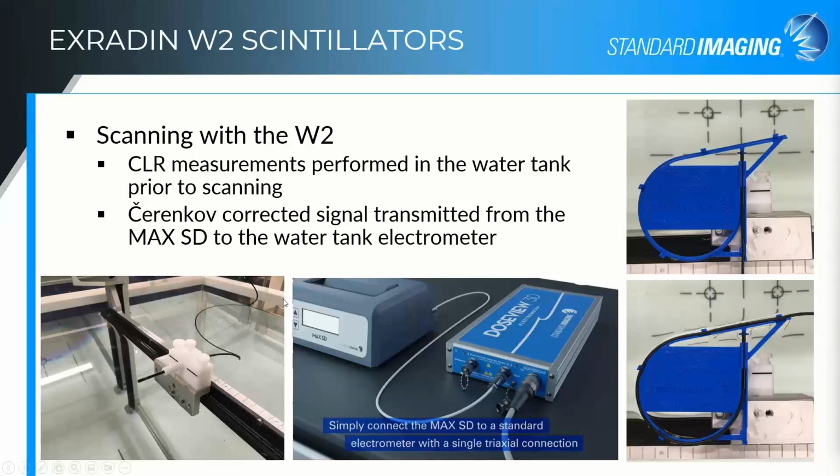You can also use what we call the rectangular field method, where you might use a 2 centimeter wide and say 20 centimeter long field, and then rotate your collimator by 90 degrees. The key really, if you're doing a rectangular measurement, is that your short dimension needs to be wide enough that you're not changing the dose to the scintillator, knowing the limitations of the walkout of your collimator and that potentially highly peaked field profile. You want to make sure that the dose to the scintillator remains the same.